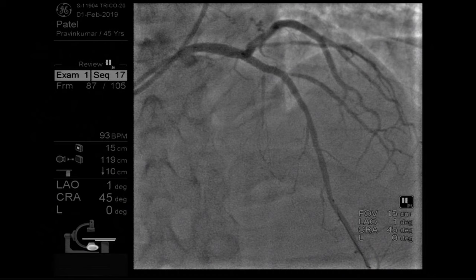Yeah, 4.5. Dr. Akasaka, I saw you measuring lumen to lumen, whereas with IVUS we measure external elastic membrane to external elastic membrane. Can you comment on the difference between IVUS and OCT? There are two recommendations for deciding the stent size and balloon size. If you use lumen to lumen, we can select a quarter size bigger balloon based on the lumen. However, we never exceed the EEL to EEL. If the EEL to EEL is 4.5, we never exceed 4.5. So the size is decided based on the lumen and also the EEL to EEL. The maximum size should be EEL to EEL. Never exceed that size.